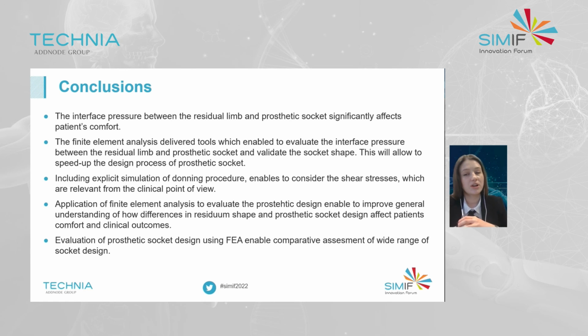The interface pressure between the residual limb and prosthetic socket significantly affects patient comfort. The finite element analysis delivered tools which enable us to evaluate the interface pressure between the residual limb and prosthetic socket and validate the socket shape. This will allow us to speed up the design process of the prosthetic socket. Including explicit simulation of the donning procedure enables us to consider the shear stresses which are relevant from the clinical point of view.